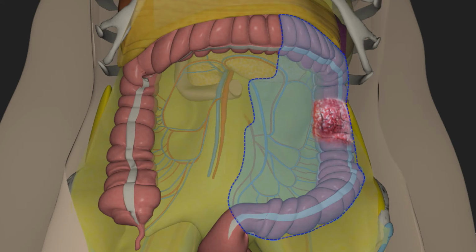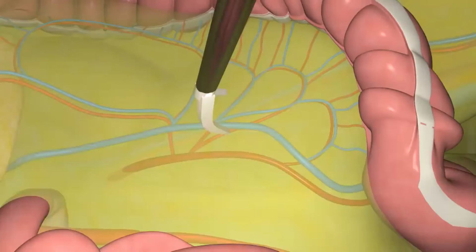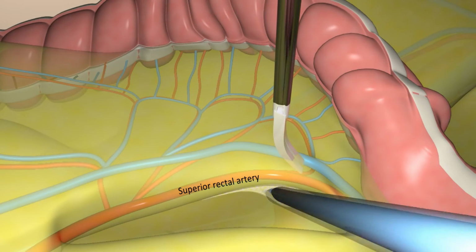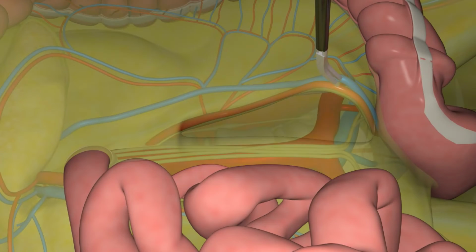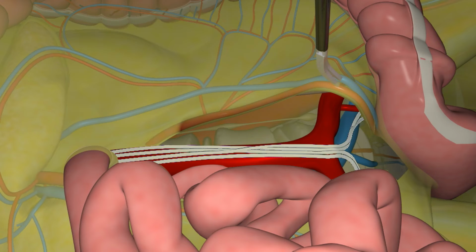In addition, for tumors of the left colon, mobilization of the splenic flexure is essential for a tension-free anastomosis. An atraumatic bowel clamp is placed on the rectosigmoid mesentery at the level of the sacral promontory. This area is then retracted anteriorly to expose the posterior space, stretching the inferior mesenteric vessels away from the retroperitoneum. In most cases, this demonstrates a groove between the right or medial side of the inferior mesenteric pedicle and the retroperitoneum. Care must be taken not to damage the iliac vessels and the ureter.